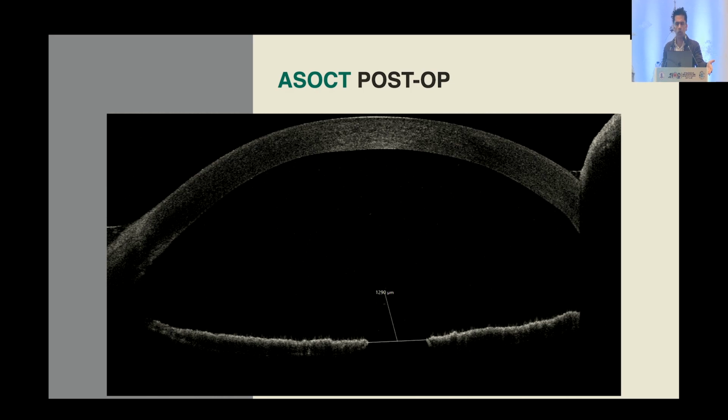Now, one big question, and this is the size of the pupil at two weeks post-op: 1.29. Big question.